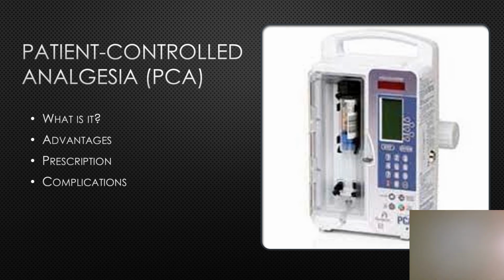Double checks should be completed with PCA administration when starting a new PCA pump, changing the dosage or lockout interval, or replacing a filled medication container with a new one. Complications of PCA are respiratory depression, anaphylaxis, nausea, vomiting, constipation, orthostatic hypotension, drug tolerance. Interventions in case of a complication: stop the infusion, notify the healthcare provider, and be prepared to administer oxygen and/or an opioid antagonist.